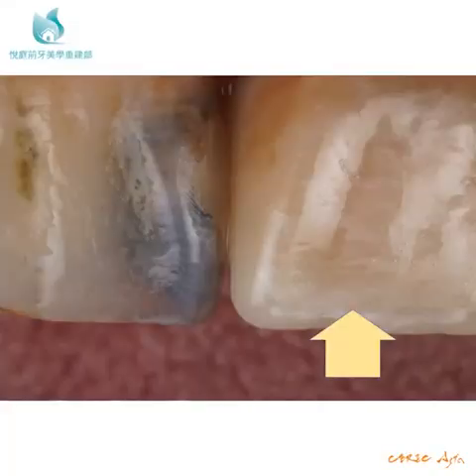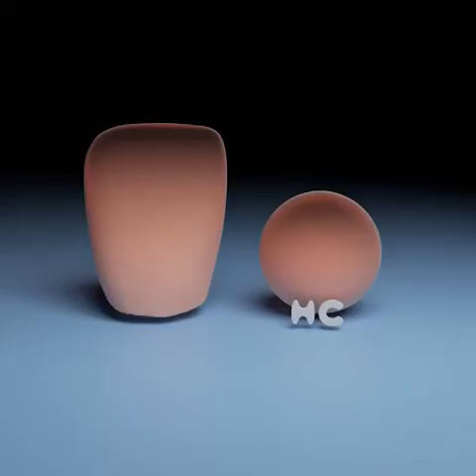In dental restorations, even for really opaque provisional materials like this, if we see more specular highlights on our restoration, it helps us to visualize the 3D contours and create an illusion of depth. So if we add a little highlight to our render here, now it looks a little bit better. The color fallout at the incisal edges give the impression that it is more translucent than the rest of the crown, and the highlights suggest shape and depth.